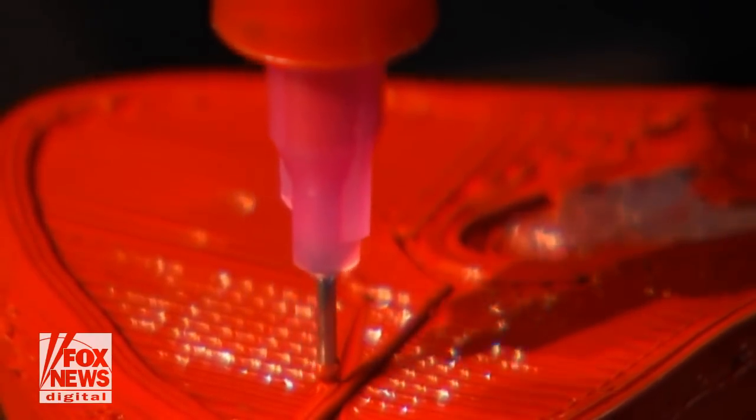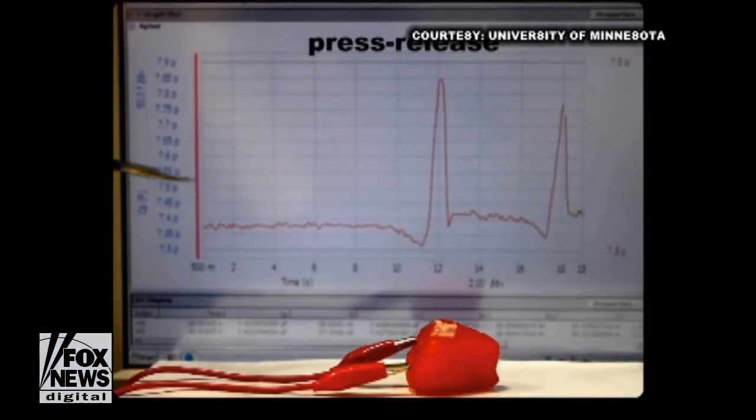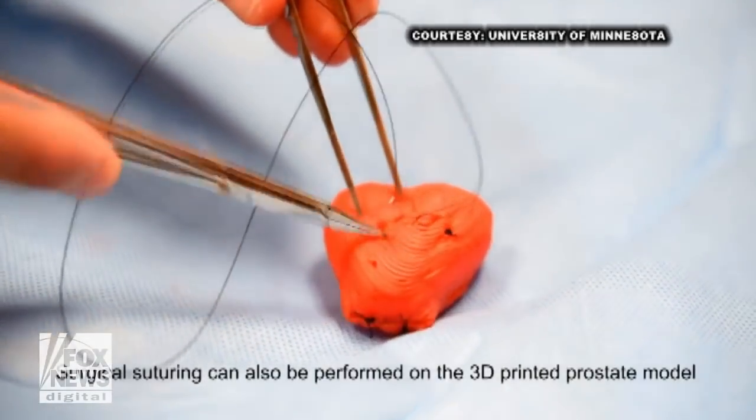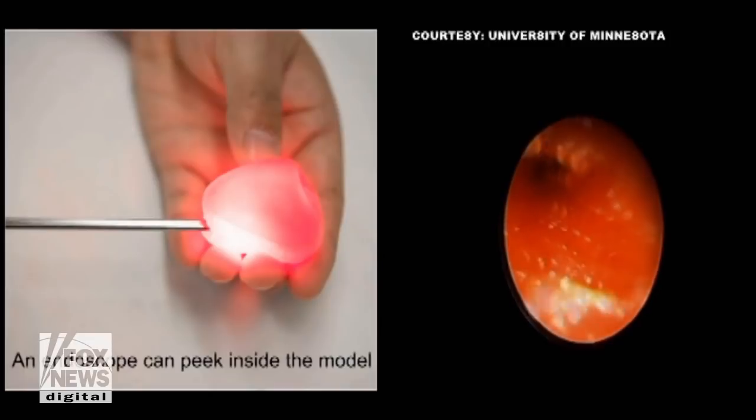the custom ink or silicone allows the model to feel and react like the real thing. So now surgeons can practice on it, they can suture it, they can cut into it, and it gives them the chance to do rehearsal beforehand and reduce medical error.